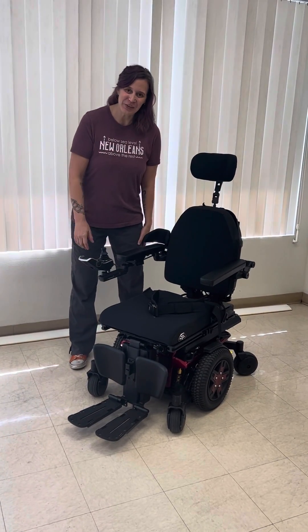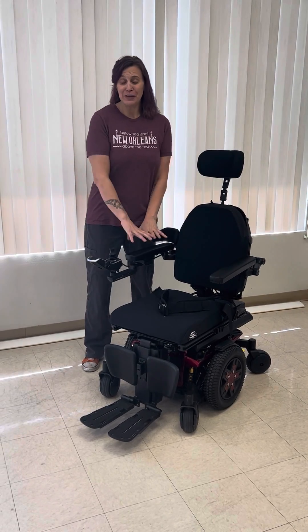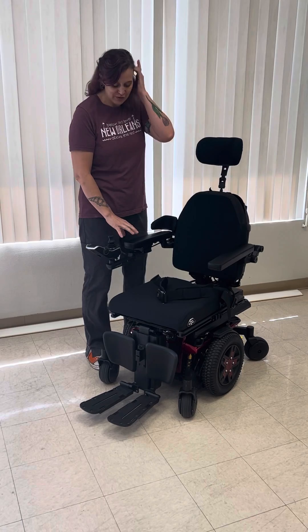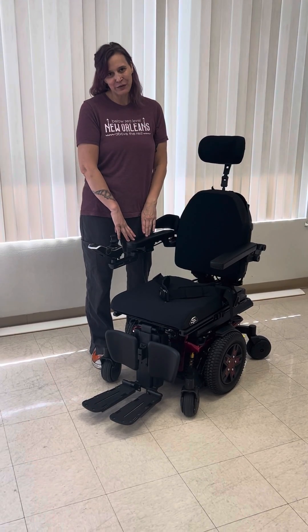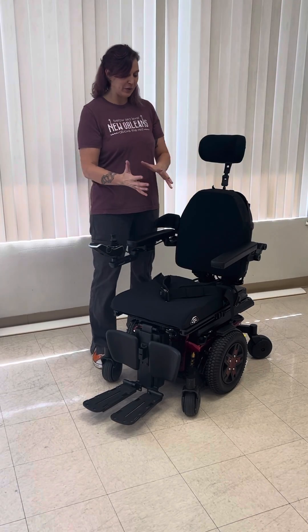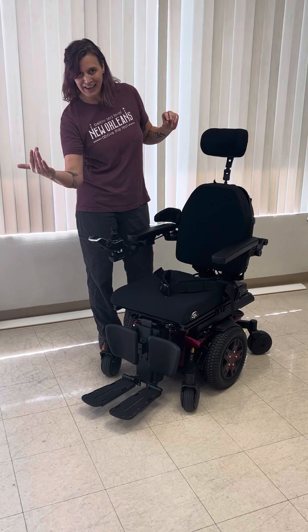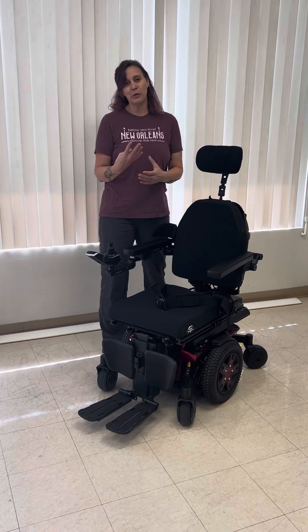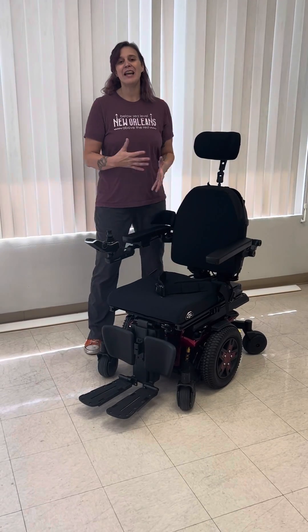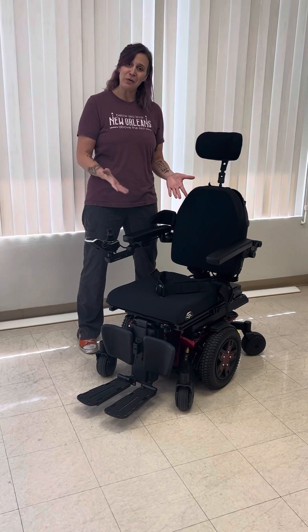Hello, this is Joy, your assistive technology professional. Today I wanted to go over a pretty new program from Quantum with their TB4 system. They started offering this last year, and if you're getting a chair and you meet the coverage criteria to have power tilt, power recline, power elevating legs, and the seat elevator — if you're getting all four of those features — this is kind of a freebie, an add-on. It's a 10-degree anterior tilt, so I just wanted to go over what that is and how it works.